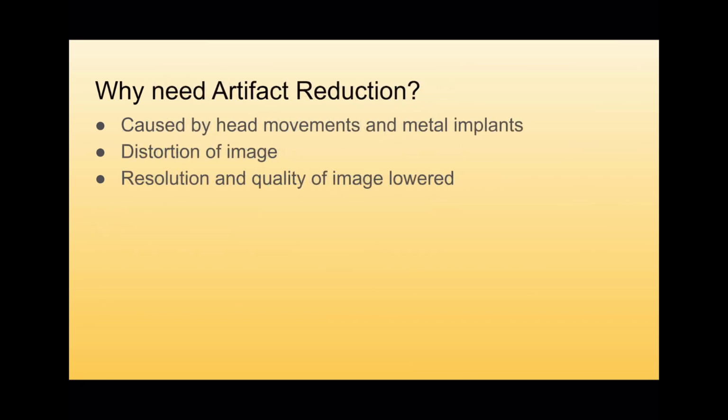Artifacts in MRI are generated by head movements and metal implants. They cause distortion, thus affecting the resolution of the image. Furthermore, the accuracy of data reconstructed will be lower. This is why denoising work needs to be done.